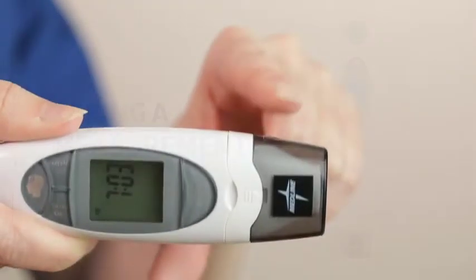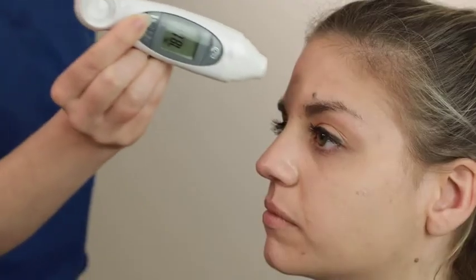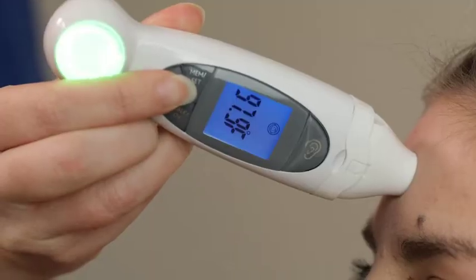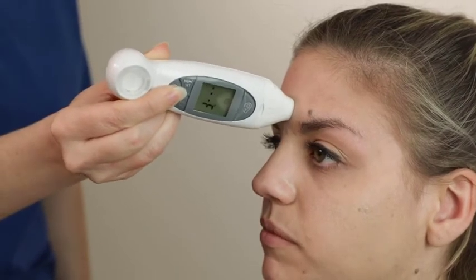To take a forehead temperature, first make sure that the probe and sensor are clean and then put on the forehead adapter. Touch the thermometer to the center of the forehead and press the forehead button, keeping the thermometer flat against the forehead. A beep or a voice announcing the temperature indicates that the measurement is complete.